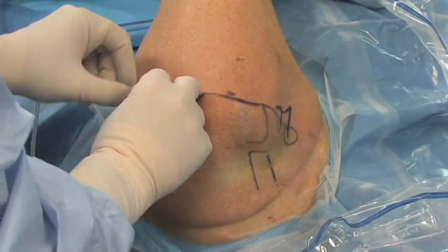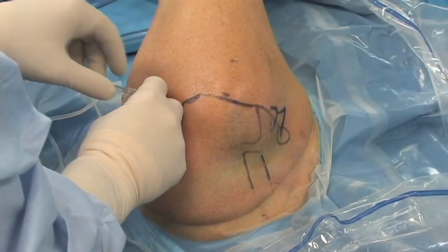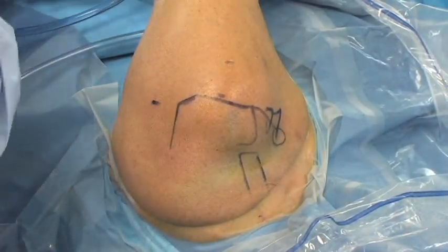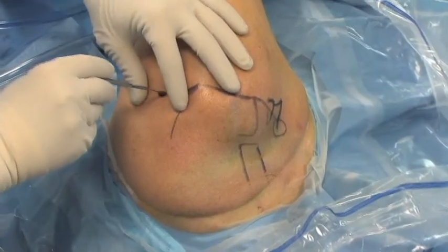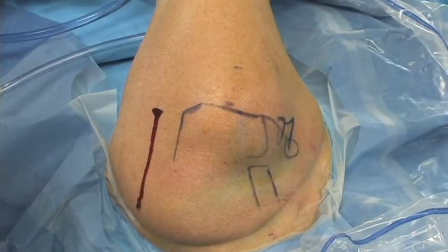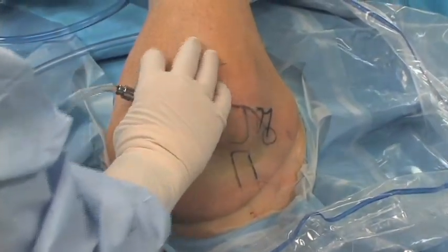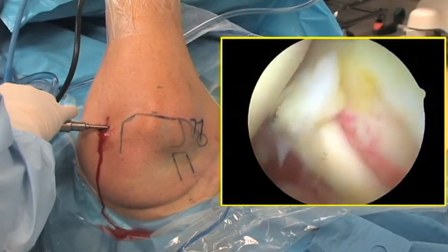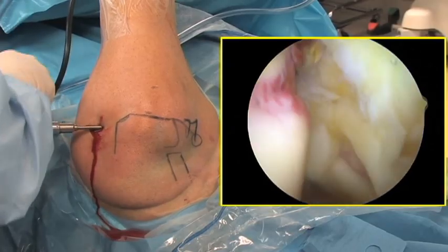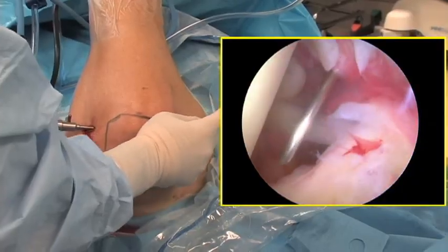A spinal needle is used to insufflate the joint. Once this is complete, an 11 blade is used to cut the skin. A blunt trocar is then used to enter the glenohumeral joint, aiming toward the coracoid. The arthroscope is then inserted into the joint and a diagnostic arthroscopy is performed. The rotator cuff is inspected from underneath and the torn tendons can be visualized.